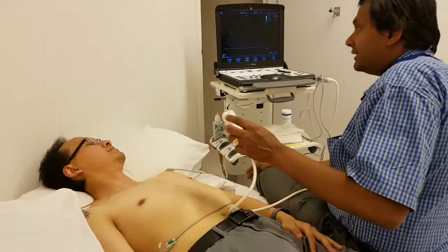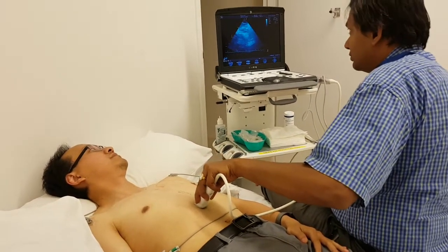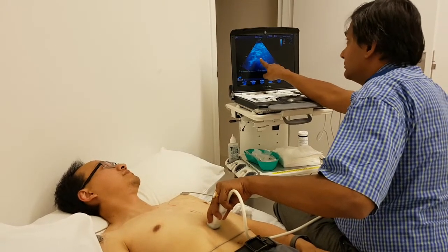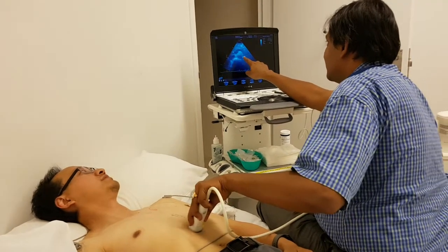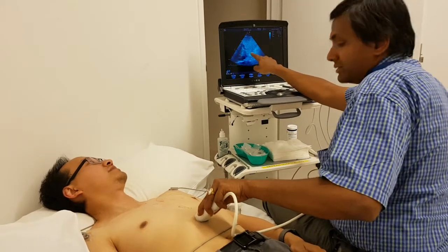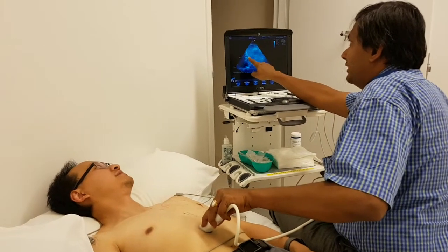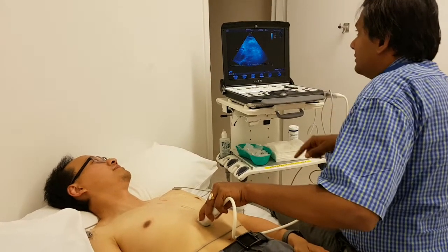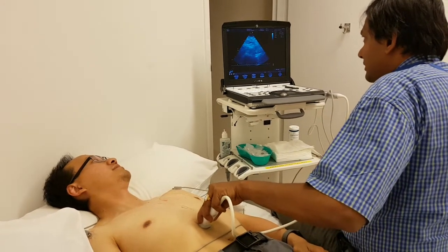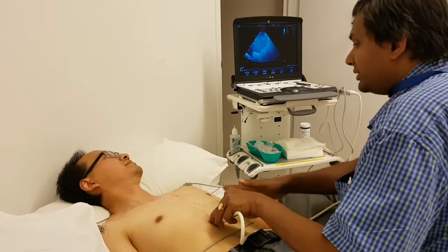I call it the dip and tilt method. What you do is you first keep the probe on the abdomen and get the liver. I'm going slightly to the right side — that's the liver, and that's your portal vein there. Then slowly I dip inside and tilt slightly, slowly towards the heart.